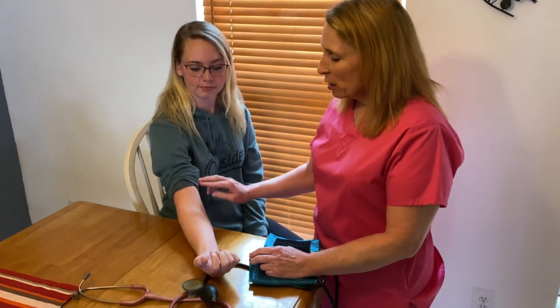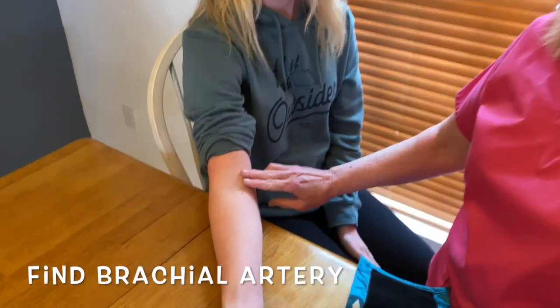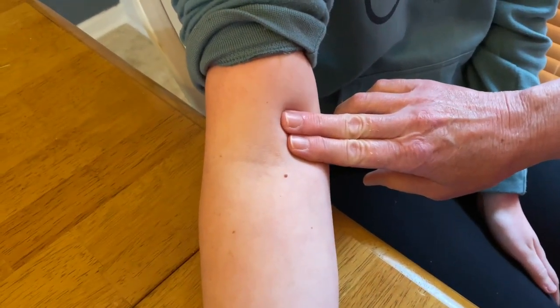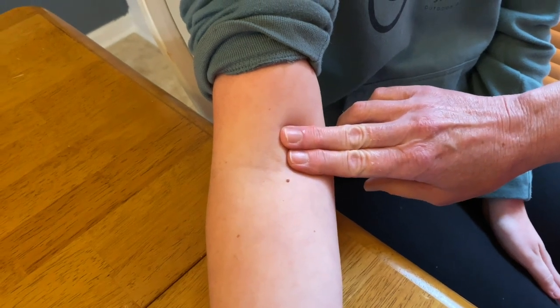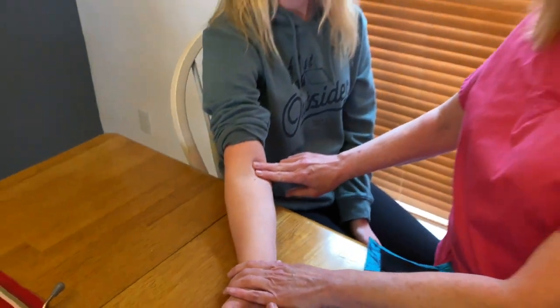Before I place the cuff, I need to identify and locate the brachial artery. So most people, it's close to the body. You're looking and feeling for a pulse. And I have found it right here.